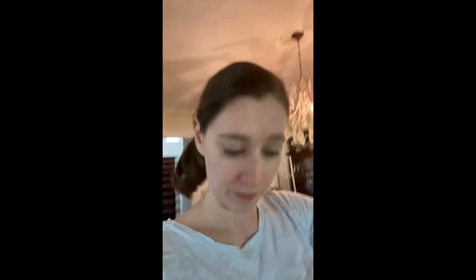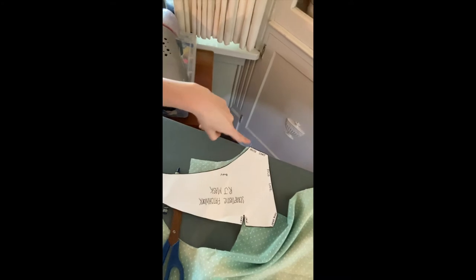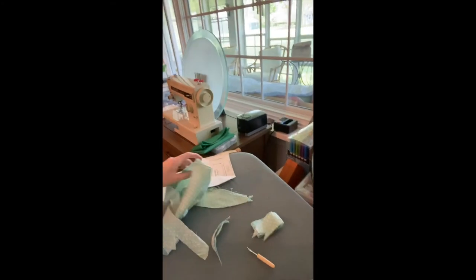First design improvement: it is no longer going into my eyeballs. I started looking at the first pattern I was using and it has a swoop here, but the Velcro pattern really didn't have quite the same dramatic swoop. So I literally traced the swoop from my original pattern onto my prototype, and that made it so I could see again. Design improvement number one.